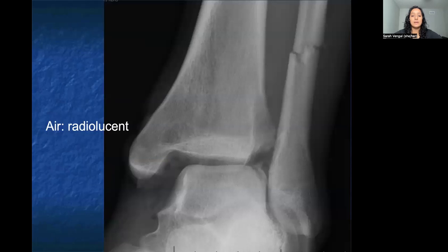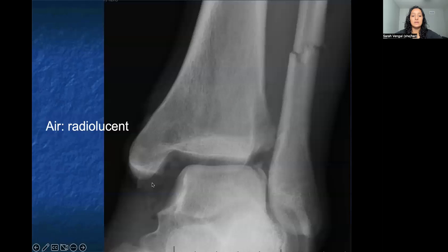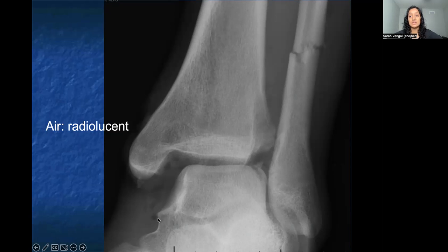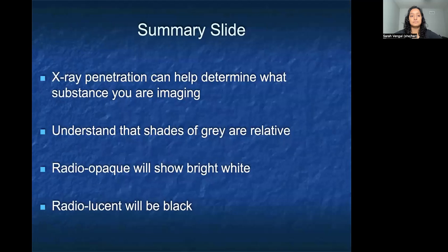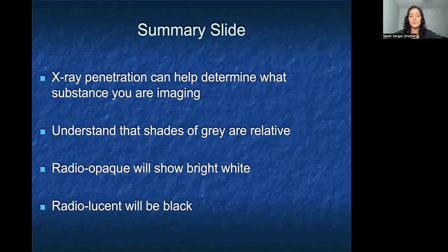In this picture, we have an ankle injury where we can see radiolucent splotches within the ankle mortise. That is a sign that there is air in the ankle joint, which in this case would be indicative of an open fracture. X-ray penetration can help determine what substance you're imaging, whether it's metal, bone, or air.